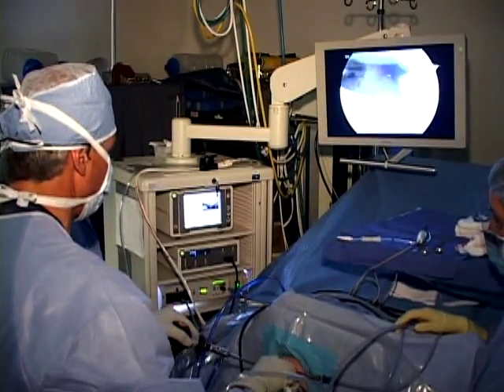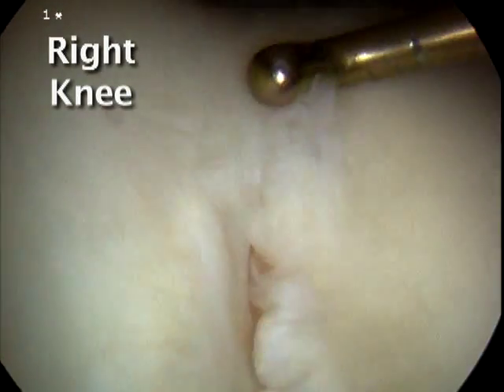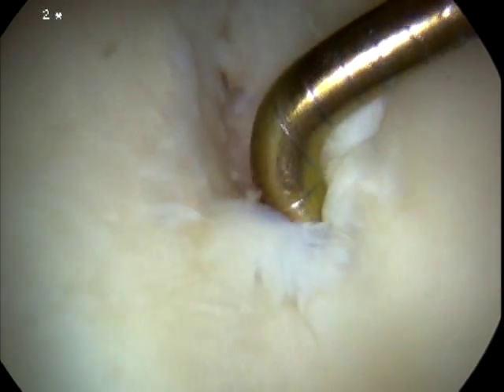Articular cartilage paste grafting is performed for full thickness cartilage lesions in the knee. It is appropriate for both chondral lesions as well as arthritic knees.